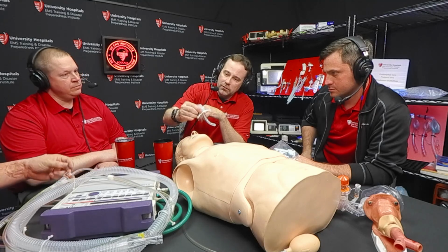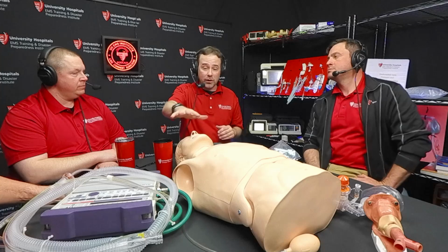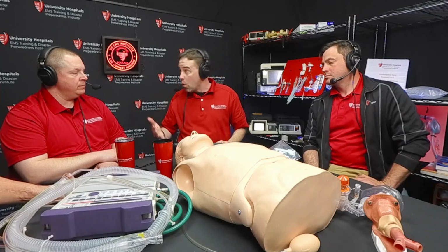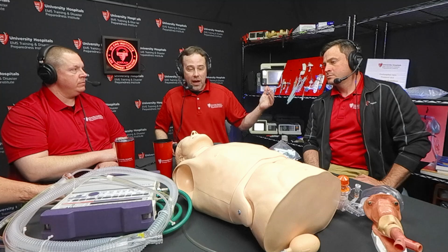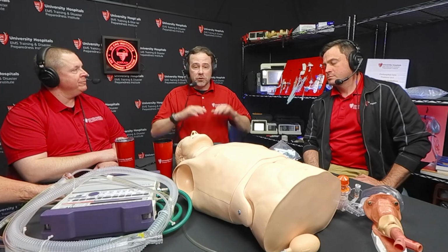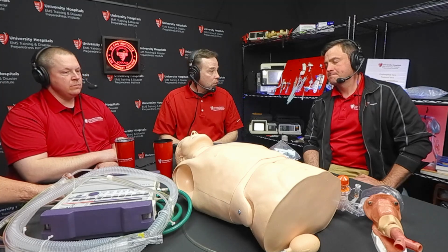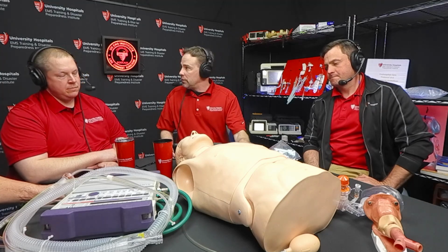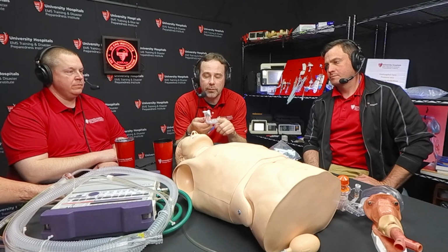Let's contrast that with somebody who may still have upper airway insult or may have an intact upper airway, but they've had some spinal cord injury, right? They've had a transection, they're quadriplegic, they're not breathing on their own, they've got no diaphragmatic control. This patient's going to need to be on a ventilator, and that's where our cuffed tracheostomies come in.